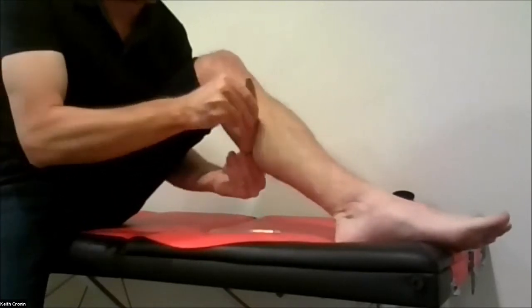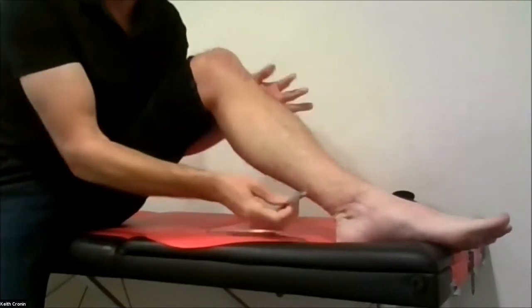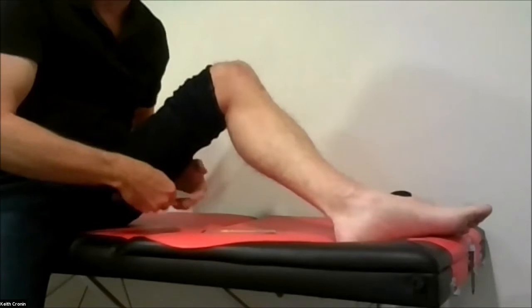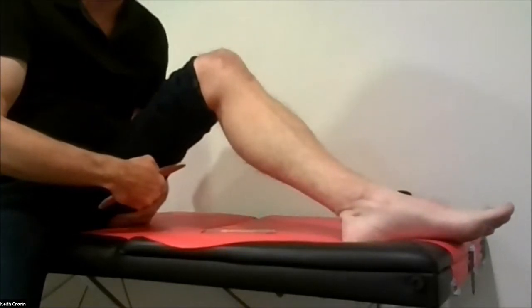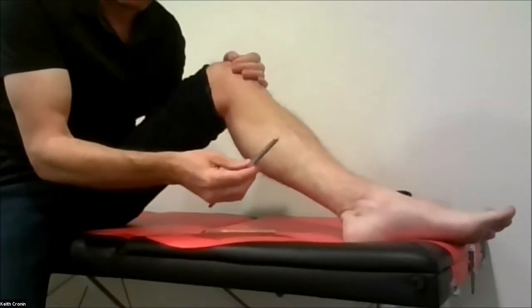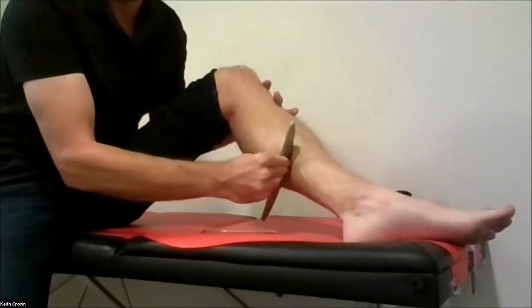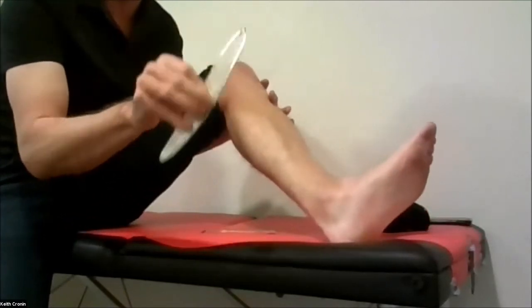Now, if you're working with a patient, what you would probably do is have them laying on their stomach. And I would work all the tissue up and around all the way through the body, even up into the hamstrings. So even though you have a foot issue, you're going to treat all the way up into the back part of the leg. And in each area you can focus for 30 seconds, maybe 45 seconds. But the goal is we're putting pressure in the skin, again, that 30-60 degree angle, and then coming up and in.